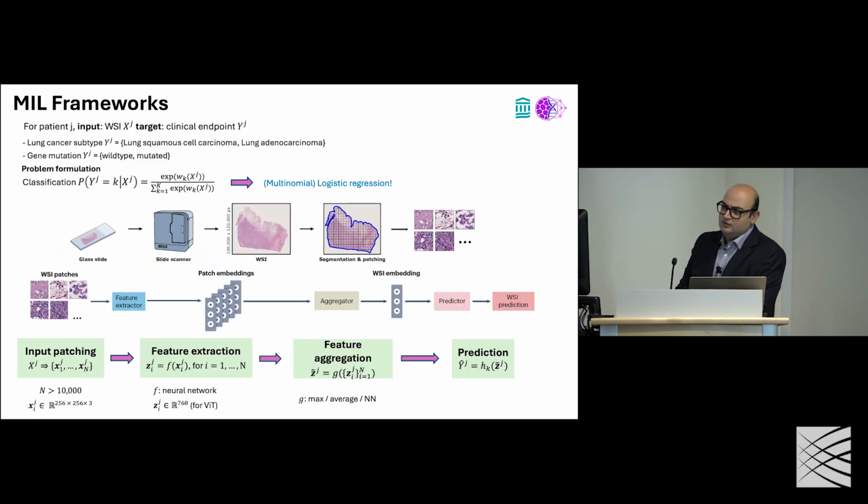So coming back to the ML paradigm that we're effectively using, it became clear that the feature extraction component is the most important component to me. I started experimenting with self-supervised learning as it was becoming popular, initially using contrastive predictive coding. Back in 2021, in a NeurIPS article, we showed that you can use contrastive predictive coding to improve feature representation for these large multiple instance learning problems.